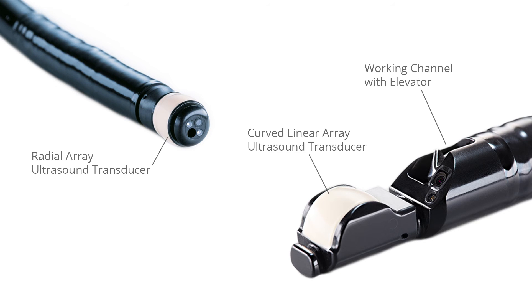The working channel with elevator. The elevator sets the angle at which instruments exit the working channel.